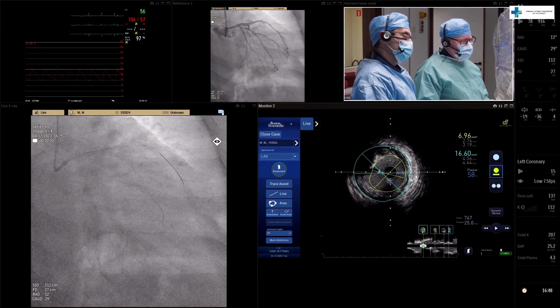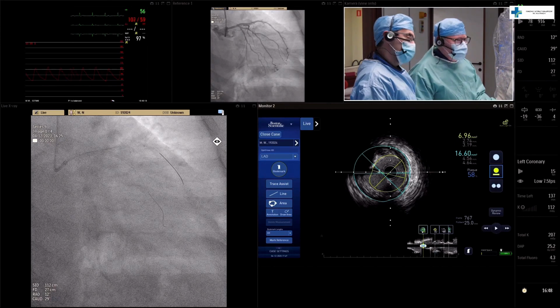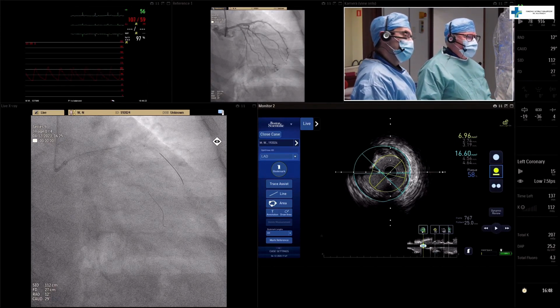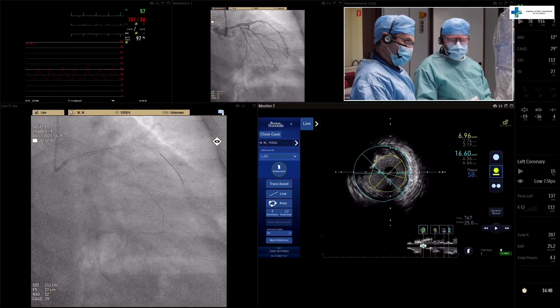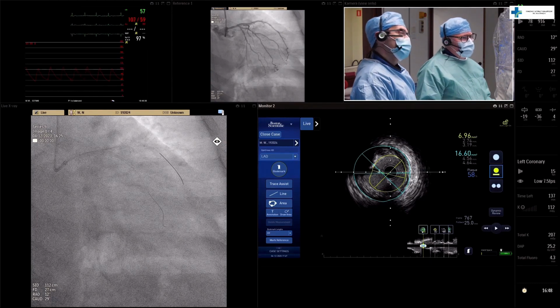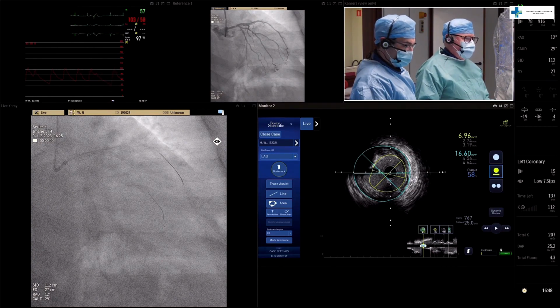However, before stent implantation, we would love to perform pre-dilatation, first with a 3.0 balloon, just to enhance delivery of the IVL catheter, because in this patient, our strategy of lesion preparation is IVL. We do not believe that we will achieve controlled pre-dilatation with a very high pressure balloon, and having this stent in the distal left main, which is not well apposed, I believe any kind of ablation would not be appropriate. So by this assessment, our choice would be to do IVL.